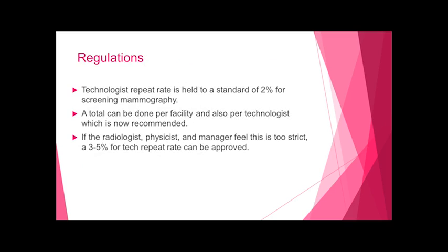The regulations state technologist repeat rate is held at a standard of 2% for screening mammography. This is usually per quarter. A total can be done per facility. Tech repeat also per technologist, so you can keep track of the facility as a whole and do each individual technologist also. And this is in screening mammograms, not diagnostic mammograms.